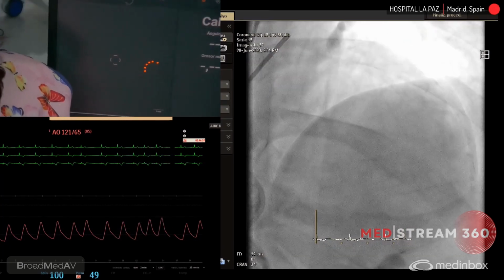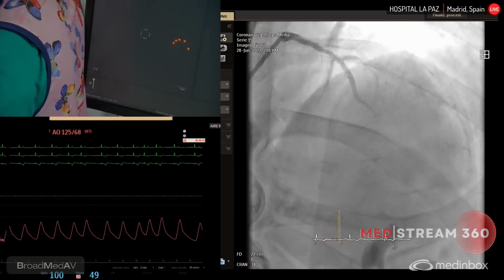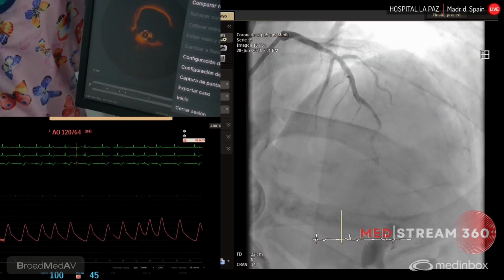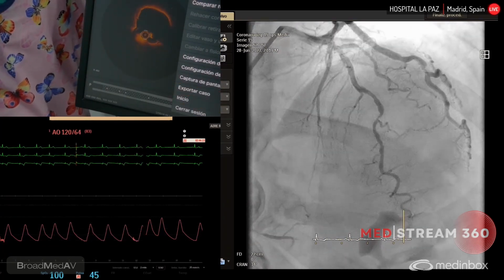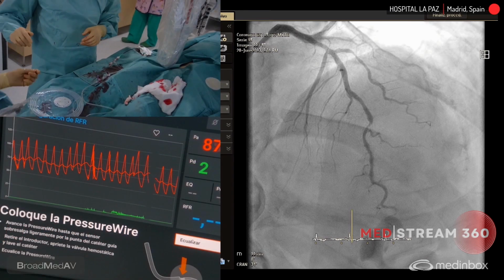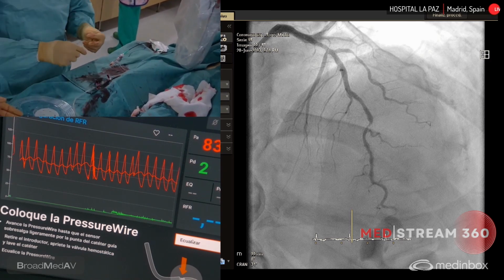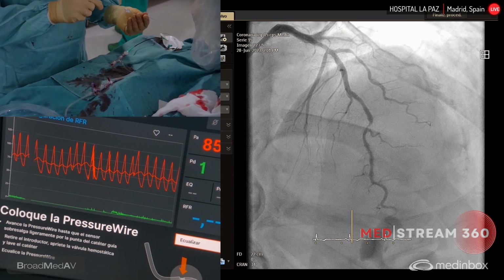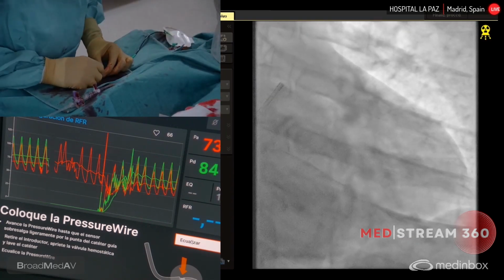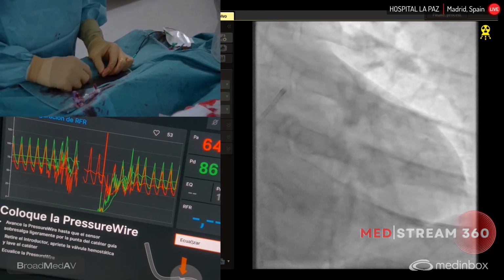So we are moving to the left artery. You can see this diffusely. This is the LAD with an angiographically severe lesion in the mid-distal part. We're going to advance the pressure wire distally to this lesion. There is some disease in the proximal part, so we have to interpret the results. The patient sometimes does funny atrial arrhythmias without a wire there.